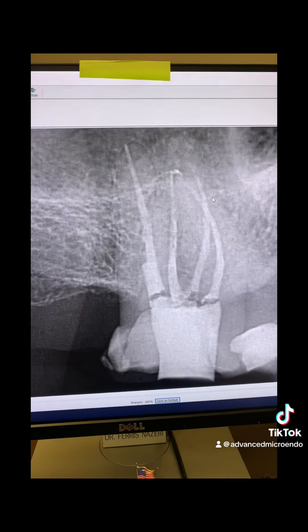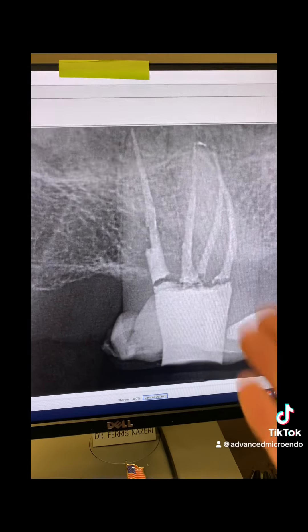MB1 and MB2, as you can see, are completely separate. That's another angulation, another angulation, and another angulation. As you can see, everything went great.